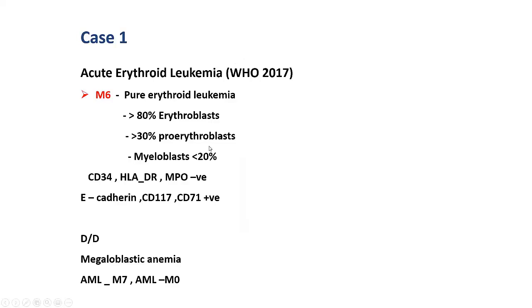But here in our case, there were about 60 to 70% proerythroblasts, and CD34, HLA-DR, MPO, these were all negative. Only these three markers were positive, confirmed, and they were also PAS positive.